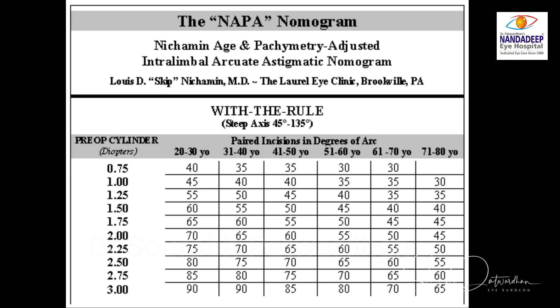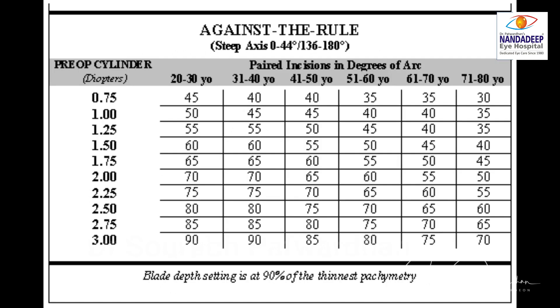We can use a 600 micron fixed depth blade or a guarded blade where we can change the depth. The depth should be 90% of the thickness of the cornea at the place where I want to do the LRI. Here I am going to use the 600 micron fixed depth guarded diamond blade.